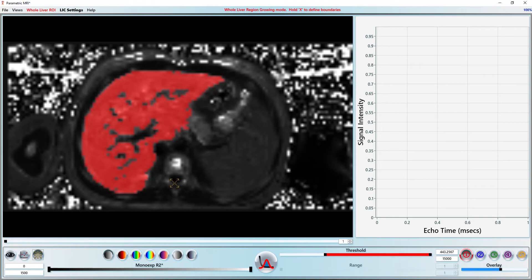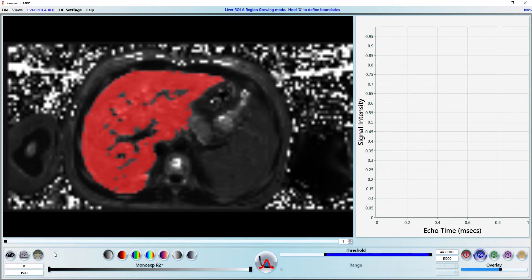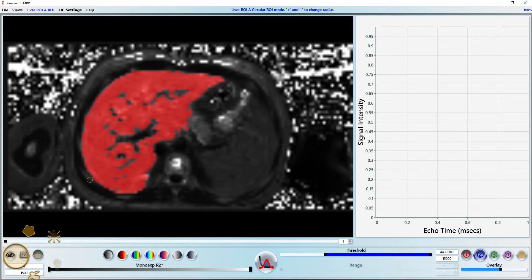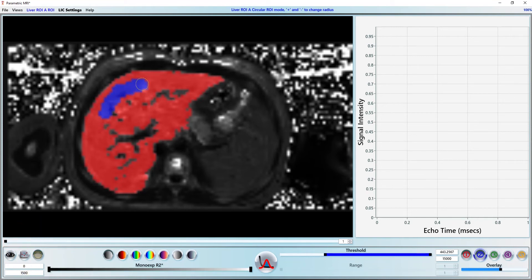While we are here, let's define two more ROIs to get a rough idea of variability in the iron distribution. First I change my active ROI to 2 and then I select the circular ROI tool and paint over the image. I do the same for the third ROI.